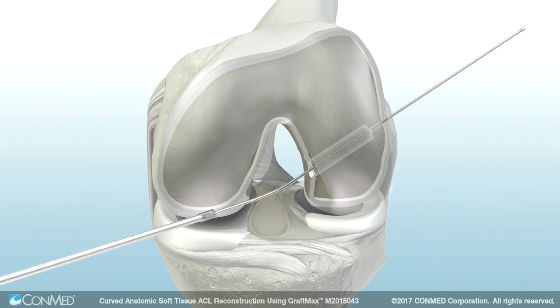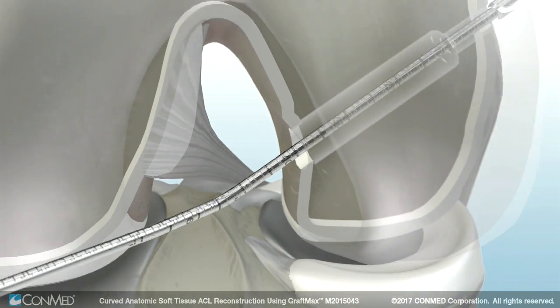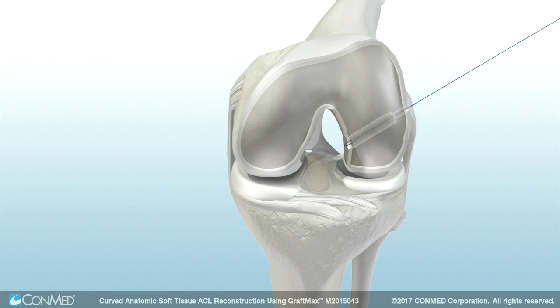Remove the FlexSentinel from the joint. Then advance the GraftMax Flex channel reamer through the lateral cortex. Remove the Flex channel reamer, leaving the FlexExact pin to be used to position a passing suture.